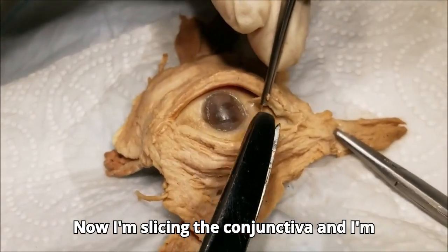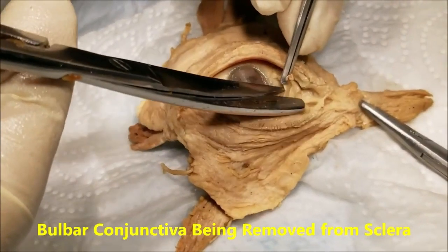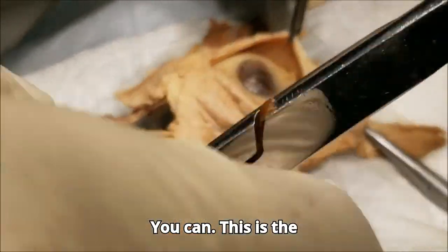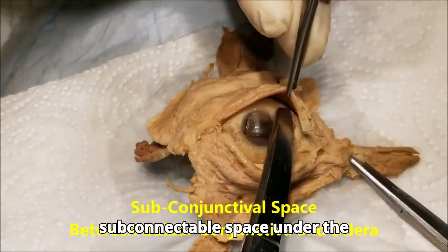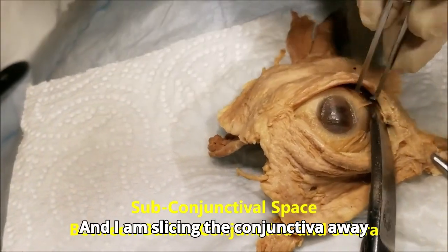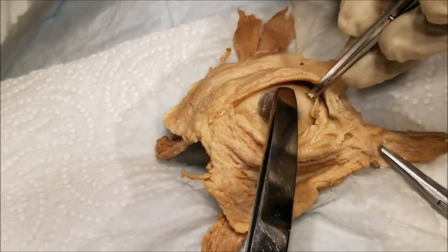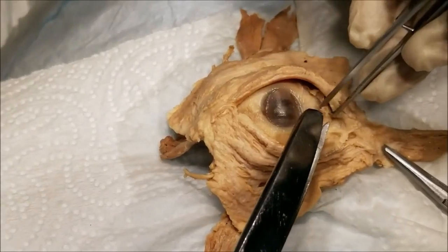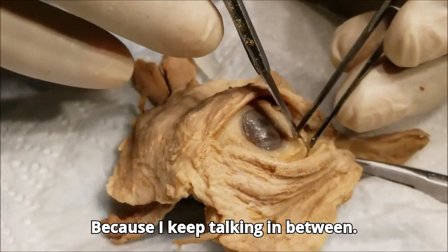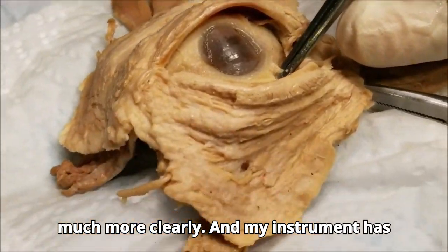Now I am slicing the conjunctiva and I am removing it from the surface. You can see, this is the subconjunctival space under the conjunctiva. And I am slicing the conjunctiva away from the underlying sclera. Now we can see the subconjunctival space much more clearly.